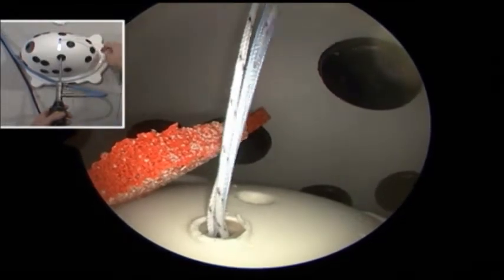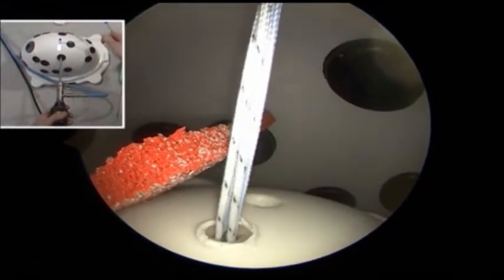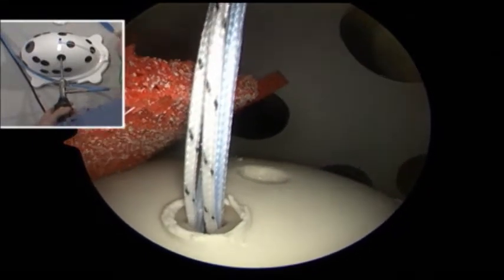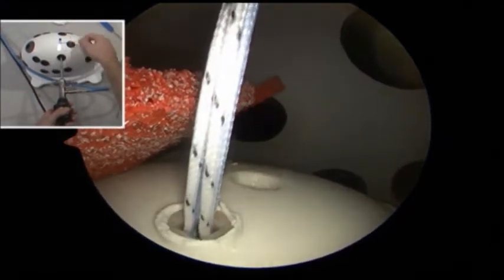So the key is to back up slightly while the insertion handle is still on the line of sutures. Visualize where your anchor is in bone. If you like it, then you remove it the rest of the way. If you don't, you can slide it right back down the sutures into the slot.